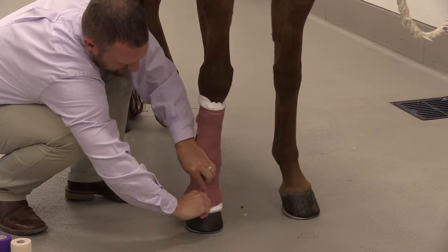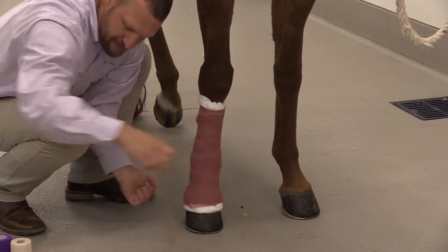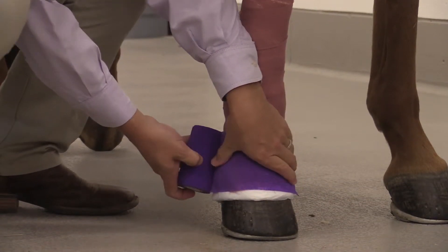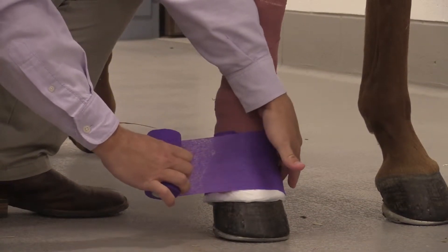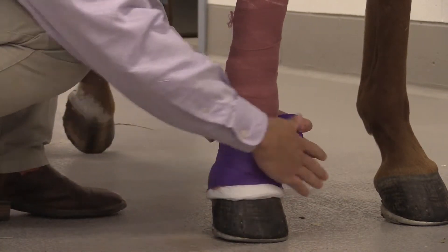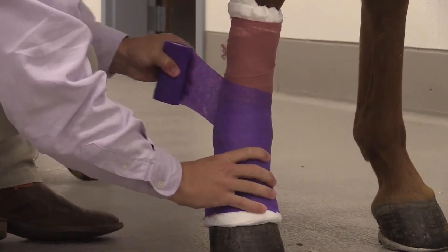You do not need to stick or tuck the brown gauze — it can just hang out because we'll have another layer that actually holds it on, and that is vet wrap. Vet wrap has an elastic component to it but does not have adhesive. We're using purple here because we are at Kansas State University and we like purple. As we get one revolution around, it sticks to itself. Make sure there are no wrinkles in the vet wrap — it should almost shine. Each layer is going on in the same direction; we're not going in opposite directions. Whatever direction we started with on the inner layer, we continue in that same revolution around the leg.